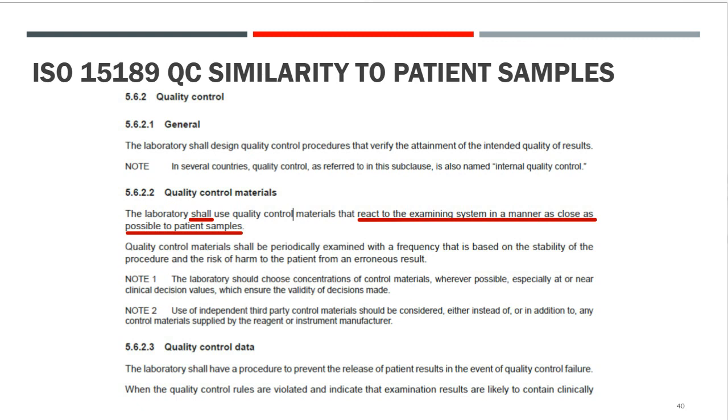Important point. And it's also implied in the prior slide where I was talking about the entire examination system, the pre-examination, examination, and the post-examination. As much of that needs to be covered as possible with a given quality control material.